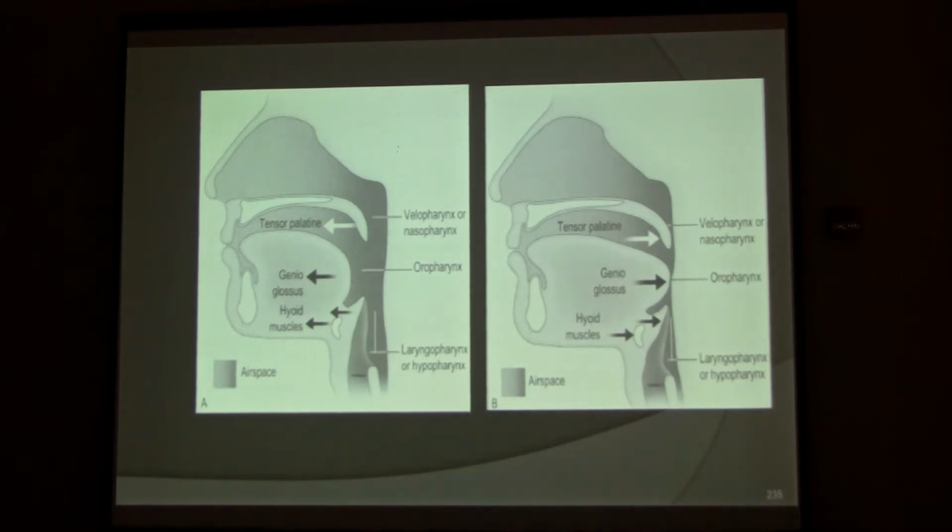And it can be controlled with the mandibular posture device quite well, to the point where the next morning they wake up and they feel better. And sometimes, because they're not as healthy, it'll be a little ramp up in terms of them getting better and better. And they'll get to the point where they'll call you, and if they don't have the appliance, they really want to be with it because it feels so good.